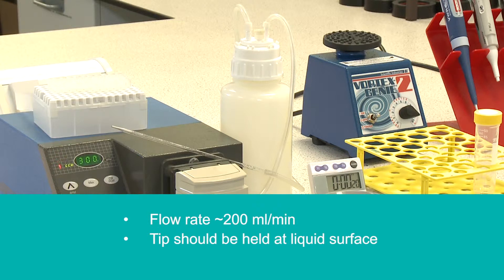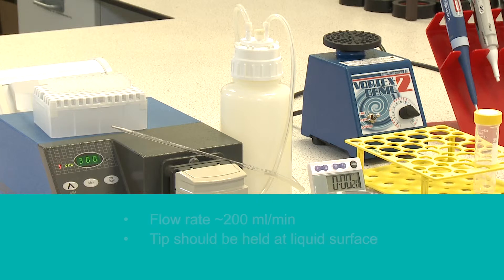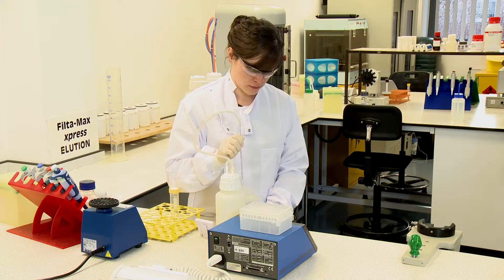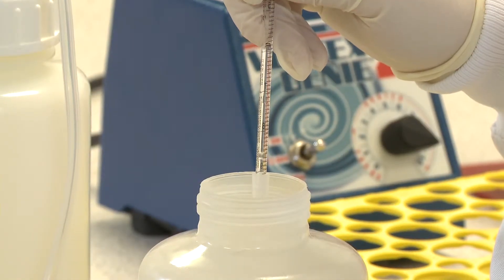Tips should be held at the liquid surface. Tubes should be placed in a holder to minimise vibration. The sample should be aspirated to 25 millilitres.